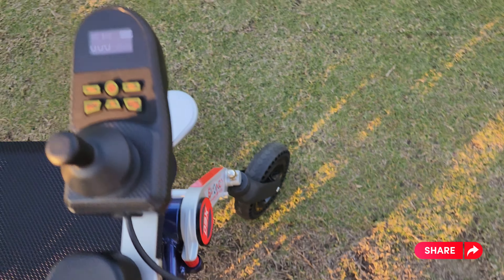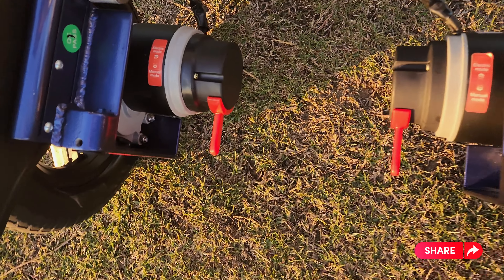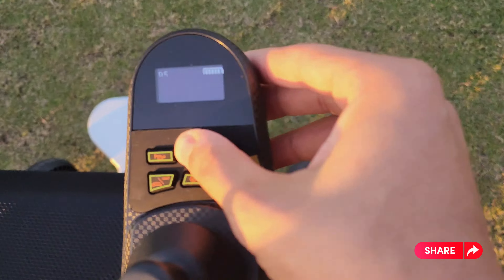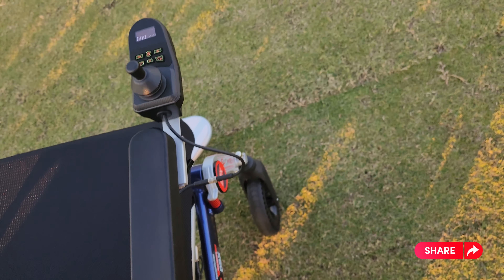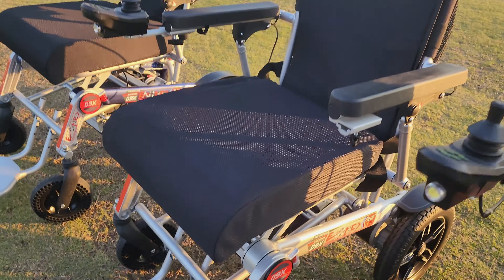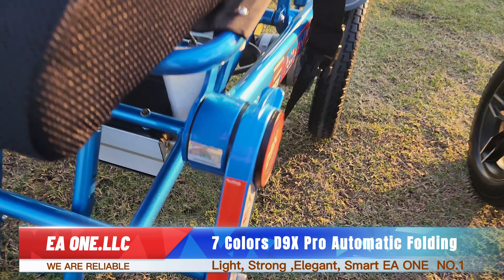If you hear a beeping sound, it means your wheelchair is in manual mode and you need to switch it to electric. Close it, go back to your wheelchair, make sure it's in electric mode — which is the one up. Open it and you'll no longer hear the beeping sound, and you can see the wheelchair works.